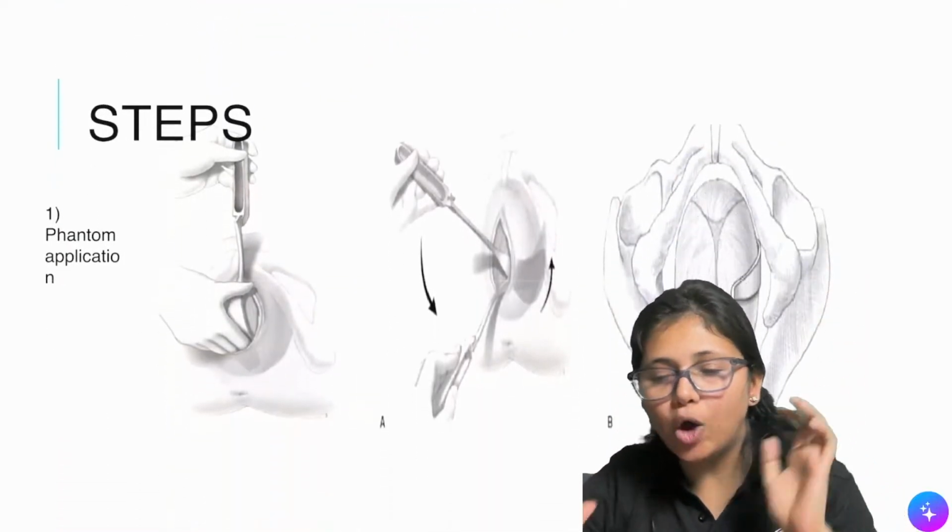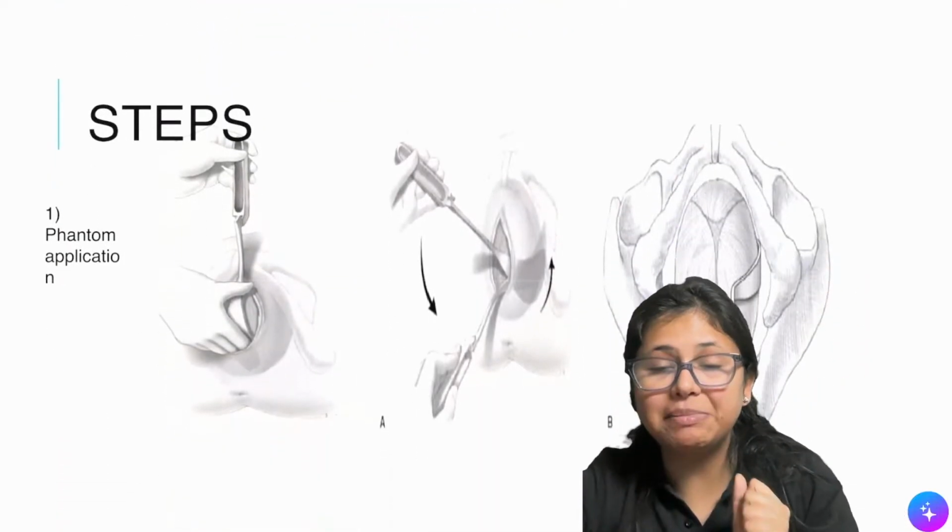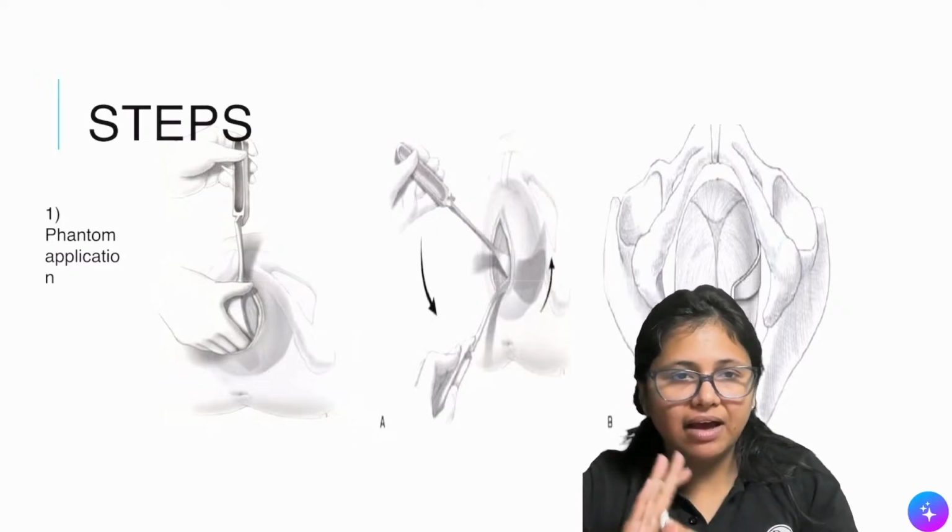Now let's talk about how we apply the forceps, and this is something that can be asked to you in your viva in your final year.